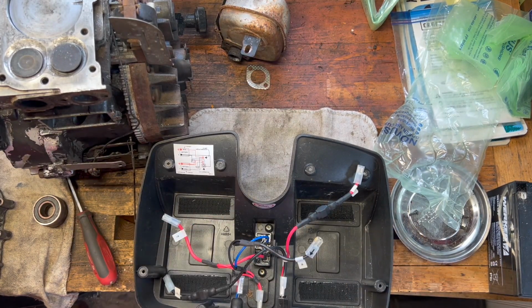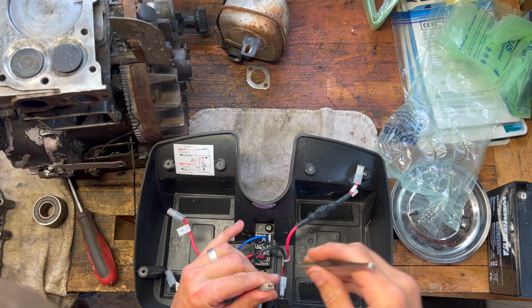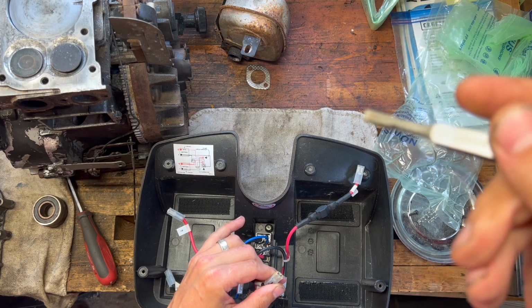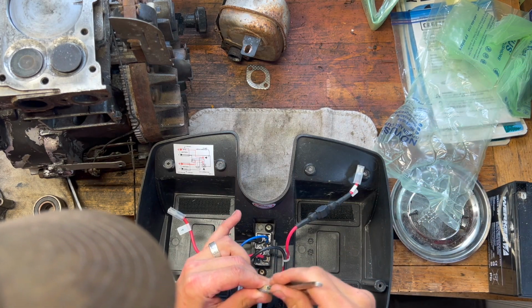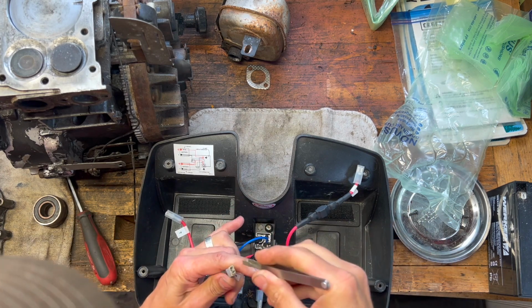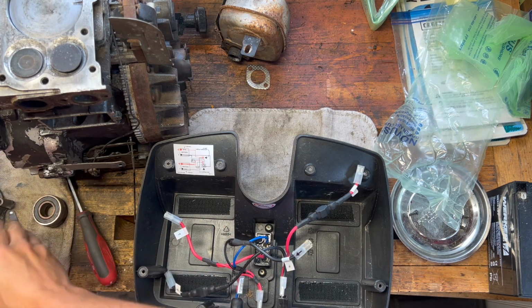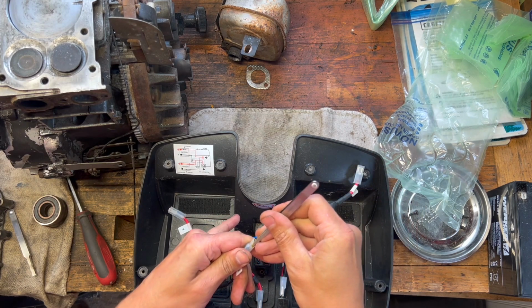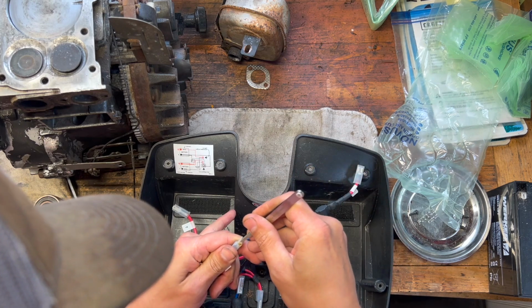All right, I got the batteries in. Before I throw them in, I just want to kind of clean up these terminals. I just got some terminal cleaner tweezers. Try to get some of this corrosion off. I'm hoping that we can just throw the batteries in and that's gonna solve everything, because if that's not the case, I'm not really sure what else we can do.